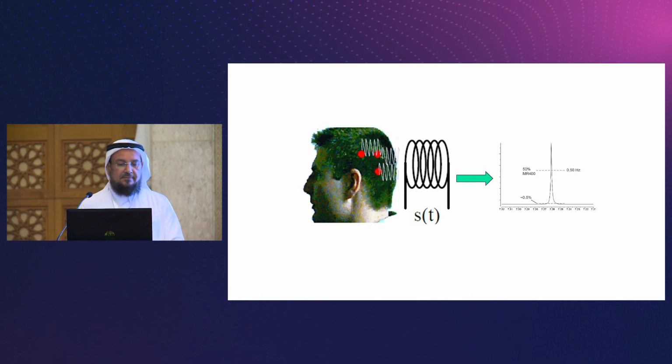So this is the patient that we just described. He has, for example, just for simplicity, 3 protons. Those protons are emitting signal. All these signals will be translated as a single peak. Again, this is not very helpful.